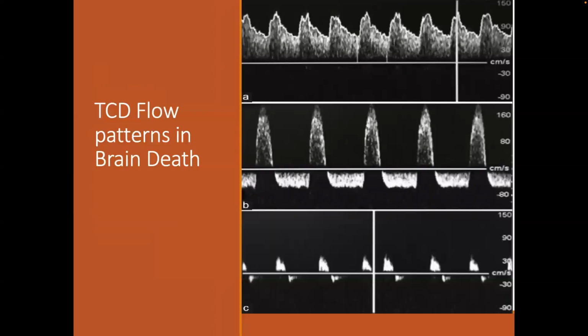Okay, so transcranial Doppler also helps in determining brain death.